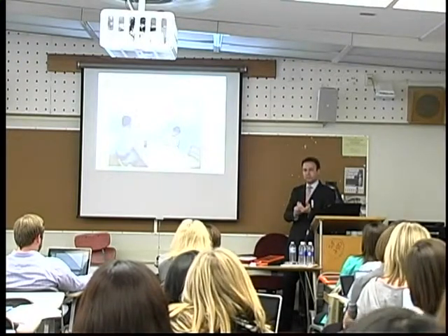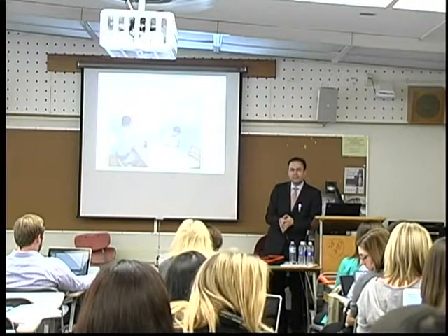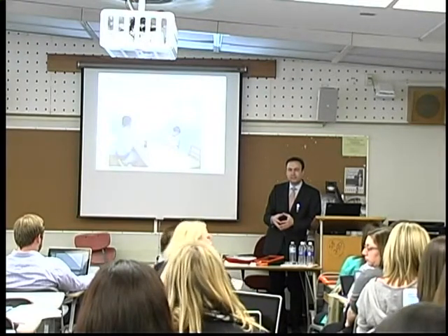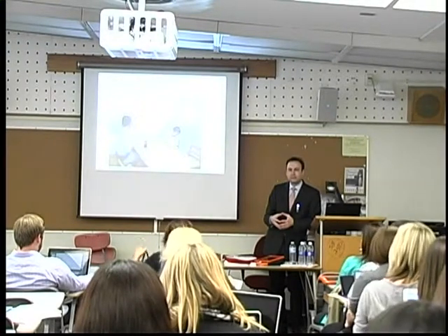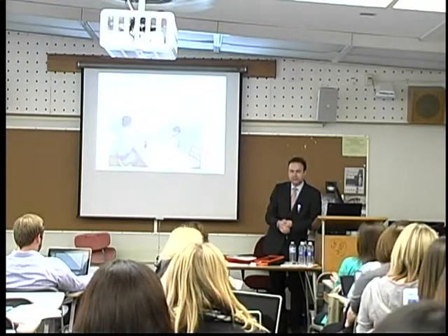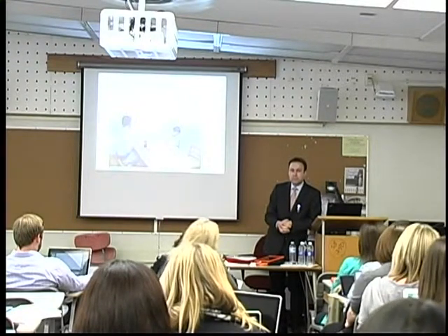The attention that is required for the drag and drop is just a little bit more than for the one-touch symbol activation. So the only reason I'm concerned is because of Allison's question about generalizing beyond the requesting. Since I work in the schools, pre-K through high school, what I would do after this kid has mastered requesting is use the AAC as a visual augmentative language, to start saying, I see candy, or I have candy, or whatever. But a lot of AAC apps have a message window on the top. I'm wondering if that would create a discrepancy for the child.